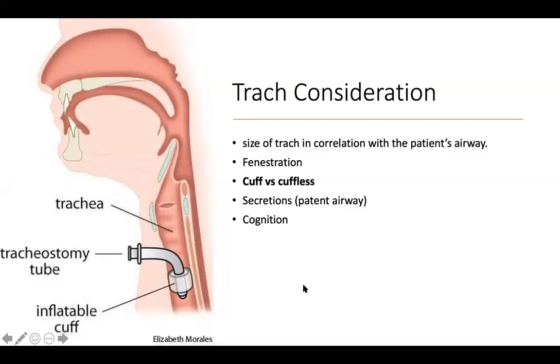Okay, that's a very nice question, actually. Will there be a difference in quality or loudness between using the index finger to close the stoma and using a speaking valve? It depends on the amount of air that is escaping to the upper airway, and we're going to talk about that in a minute. But definitely, if you occlude with your finger, the patient is inhaling through his nose and exhaling through his nose, so he would have a better upper airway mechanism. His voice, his swallow, his reflexes are going to be better.